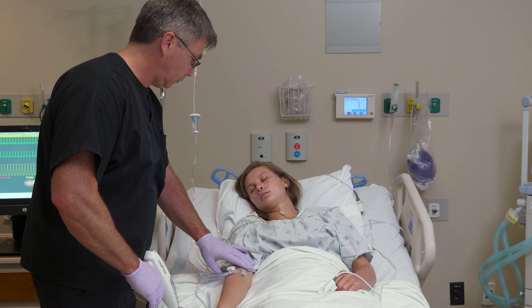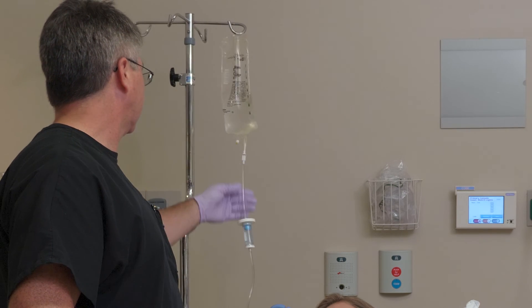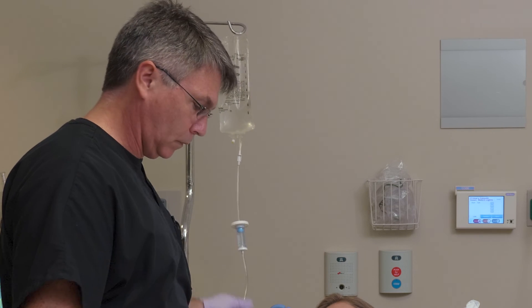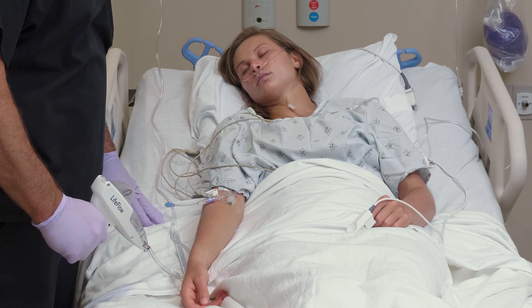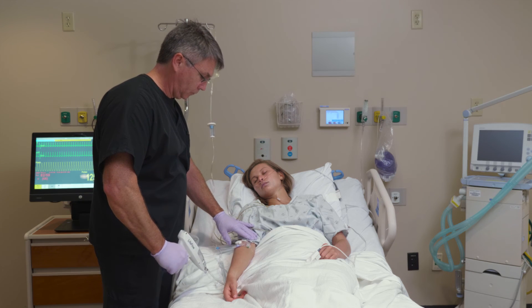Using the LifeFlow, a trained user can on average deliver 1 liter of fluid through a 20-gauge catheter in less than 4 minutes. The LifeFlow should be discarded after 24 hours of use or after infusing 4 liters of fluid.